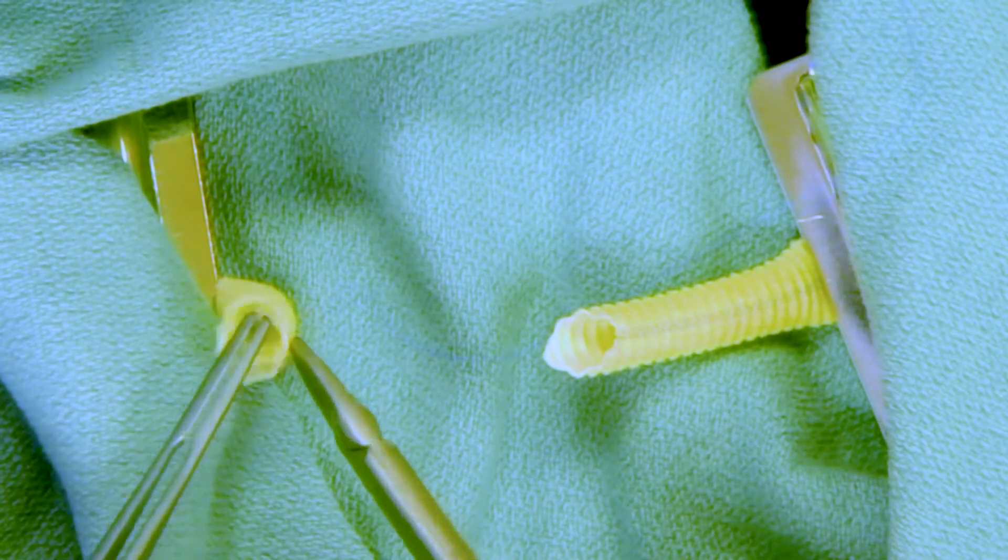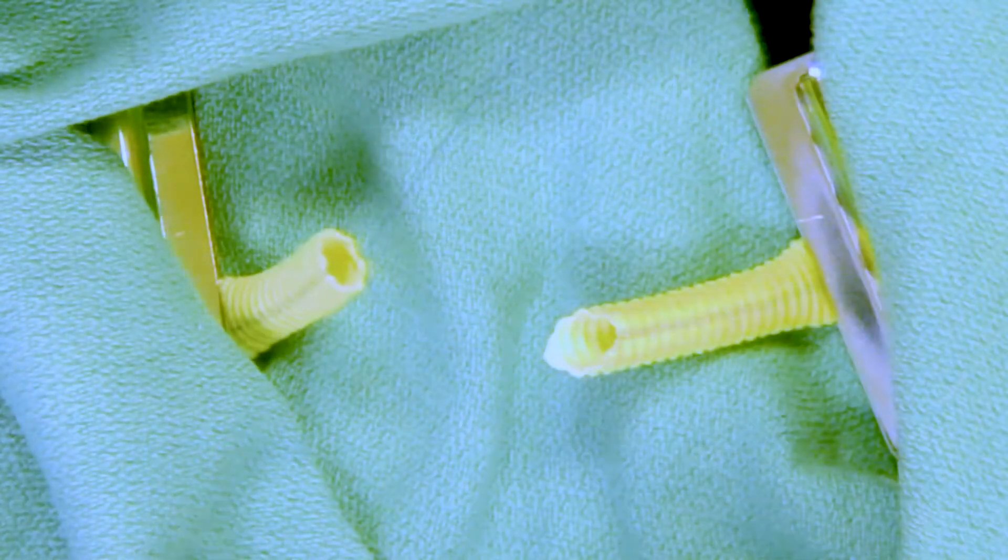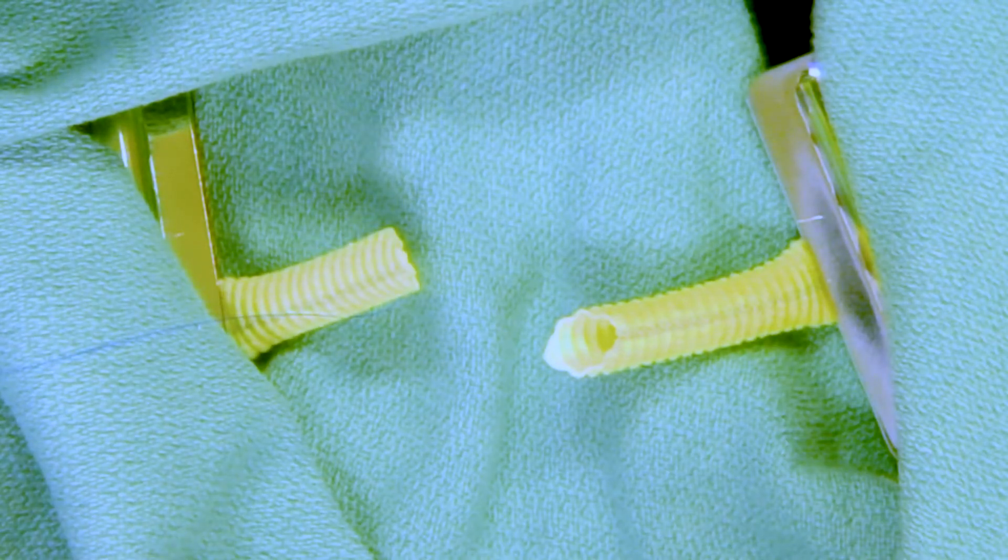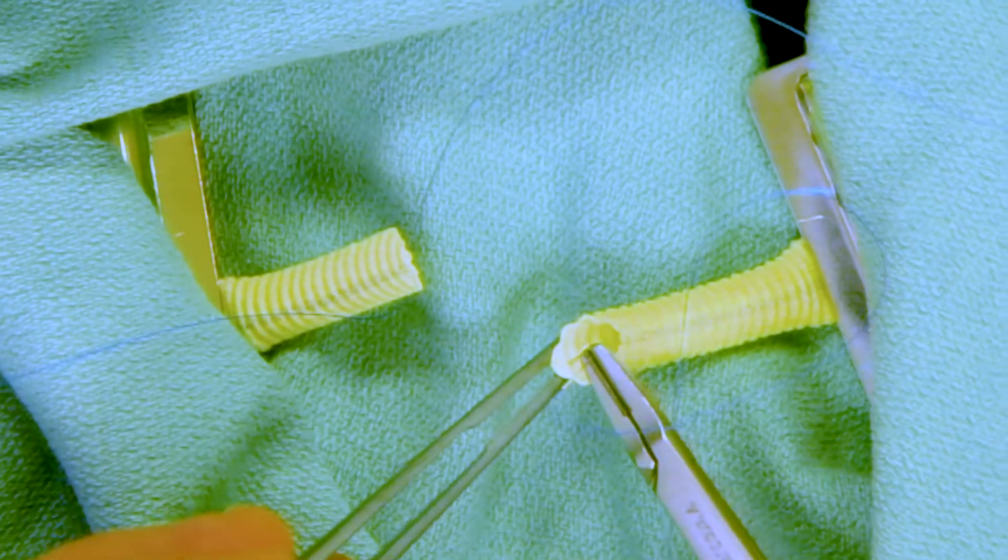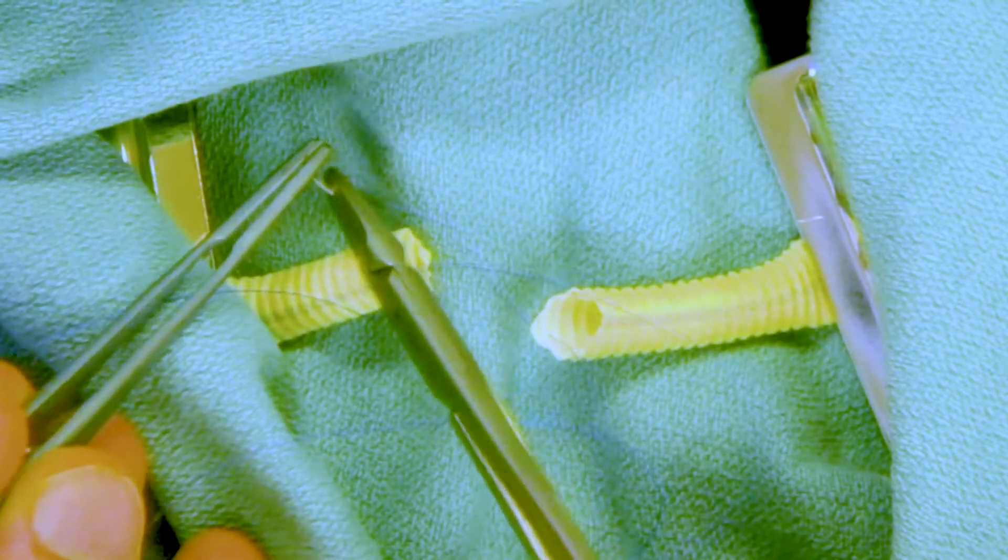We start the anastomosis on the outside of either side, in this case the heel of the graft on the left, and in this case we're parachuting the anastomosis, meaning we're not going to tie down the knot for the first pass of the suture.